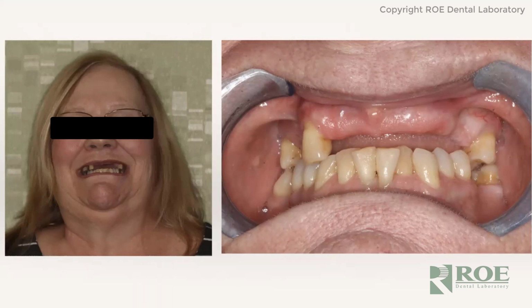And do we need to have some sort of printed try-in done beforehand? Or do we feel comfortable that if we talk to the lab, opening it up just 2 millimeters might be enough with the reduction in bone, and we feel confident that we're going to look at the prosthetic design that the lab has come up with.